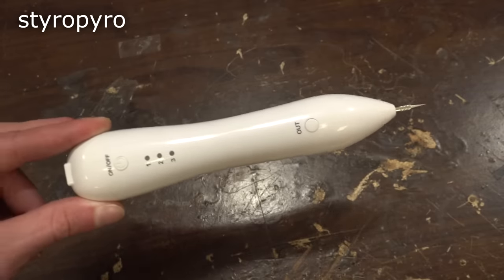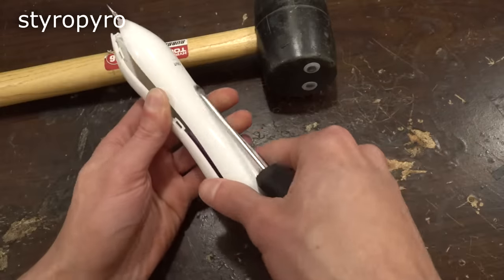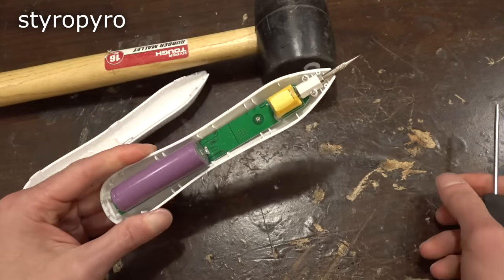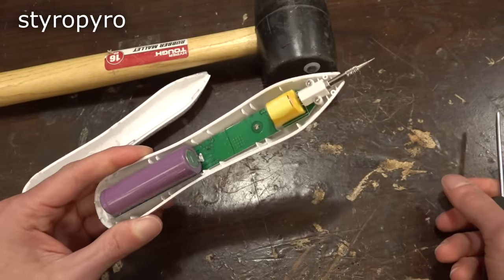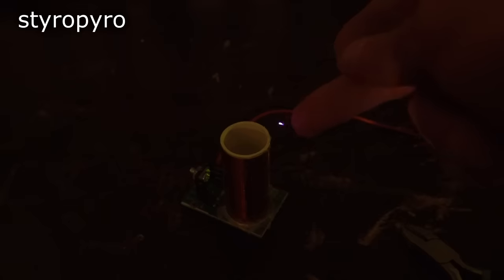I'm curious what's actually inside this thing, so I'm going to tear it apart. Wow, the FDA and FCC would have a stroke over this. What is this — a Slayer Exciter circuit? The burns from this thing feel a lot like the burns my Slayer Exciter gives me.